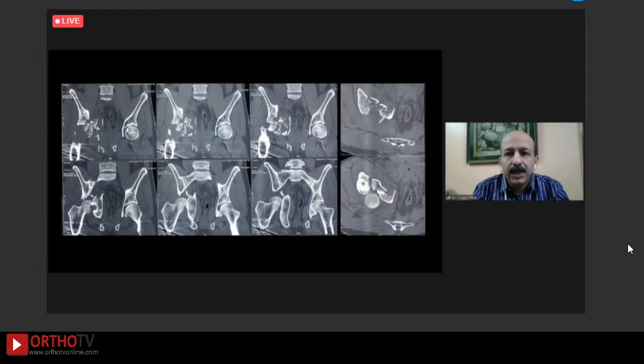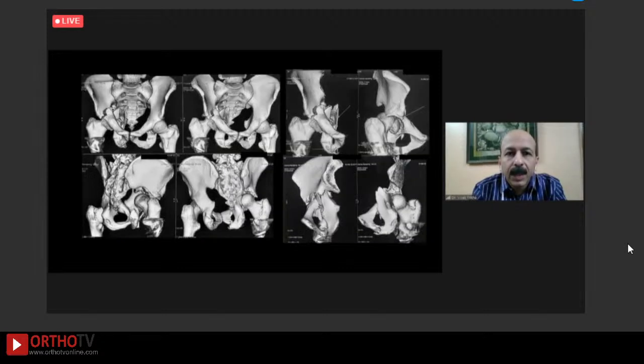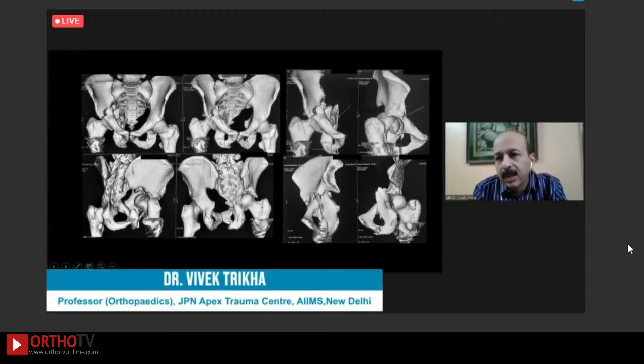If you look at the coronal images, again, we see that the head fragment is also a big fragment. And also there is a lot of comminution at the acetabular column region at the quadrilateral plate where this fracture has happened. And this is what we see in the CT scans as well: a femoral head fracture along with most likely a dislocated hip, a subluxation and dislocation of the hip joint, and the femoral head lying outside on the posterior aspect with comminution and probably a T-type fracture of the acetabulum.